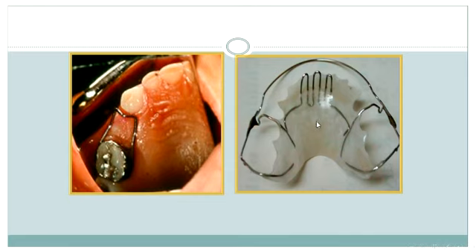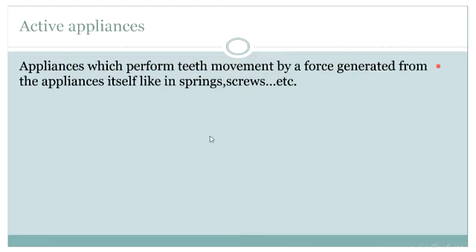According to the type of malocclusion and the recommendation, we can construct this type of passive removable appliance.